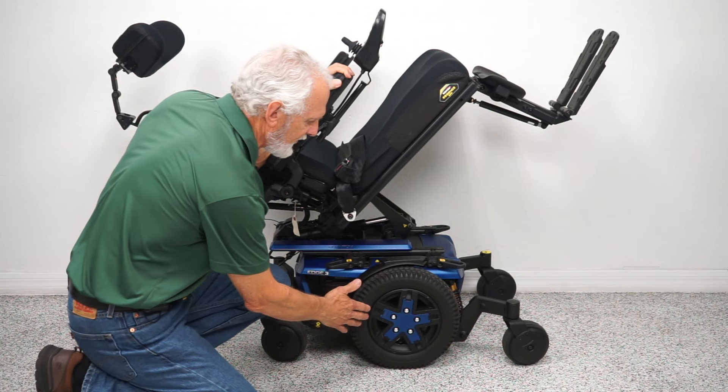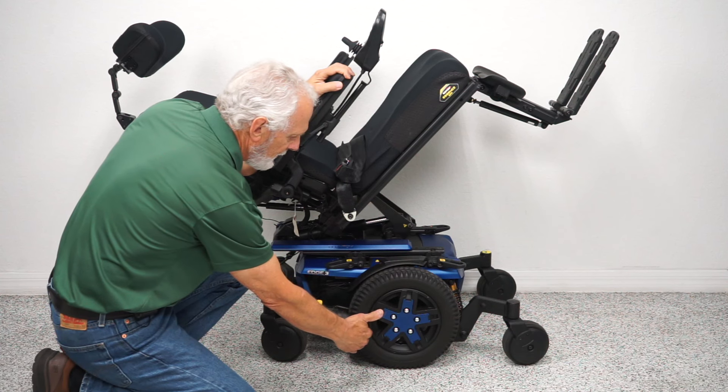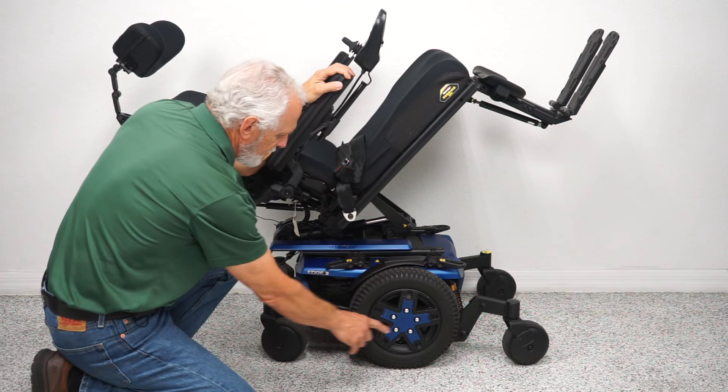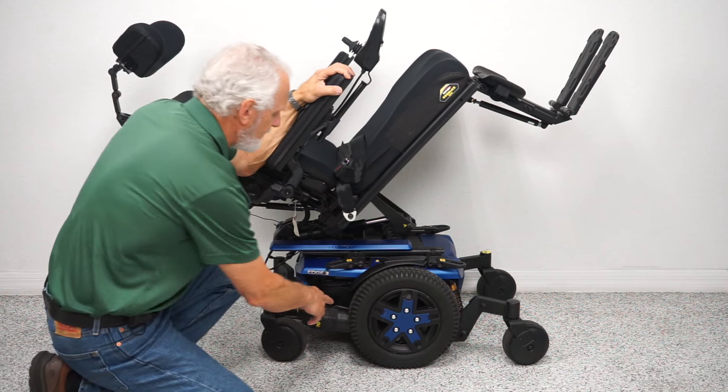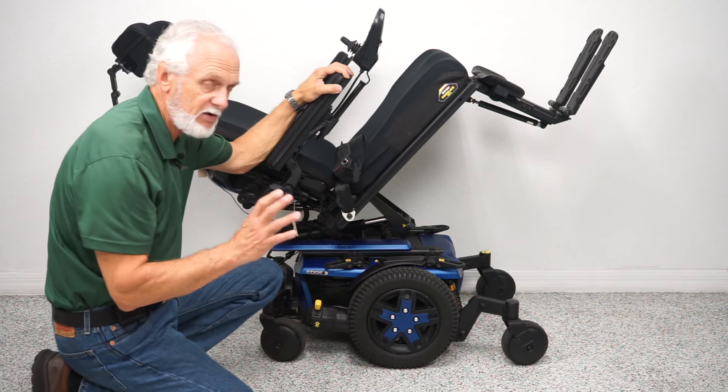Let's look at the base. It's a mid-wheel drive, which has the best turning radius because you have the drive wheels in the middle. There's a motor for each wheel on each side, and these motors are connected directly to the hub — there's no chain, no belt, that's why they're so quiet.